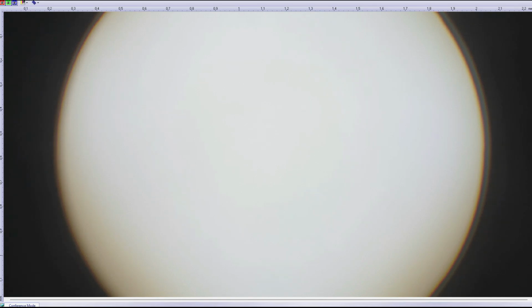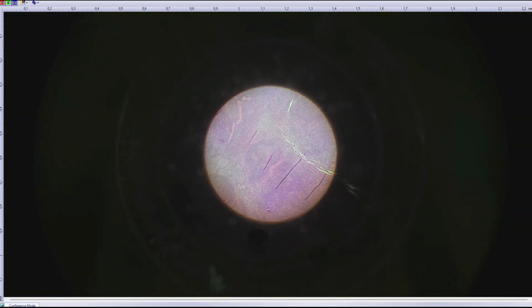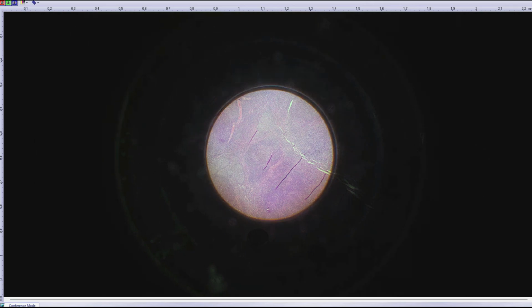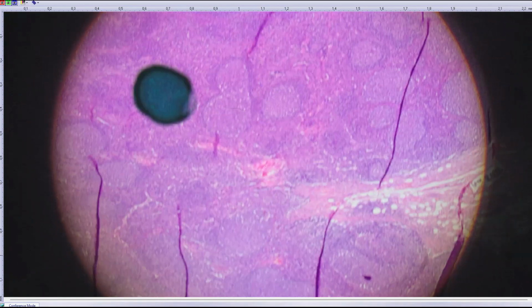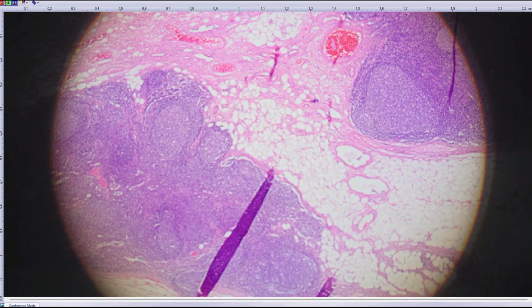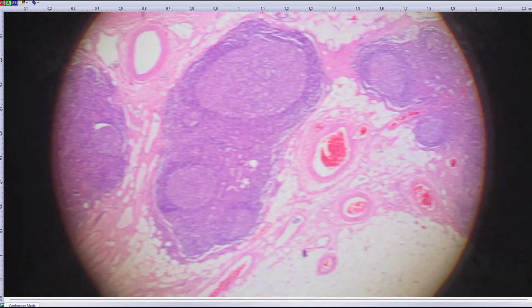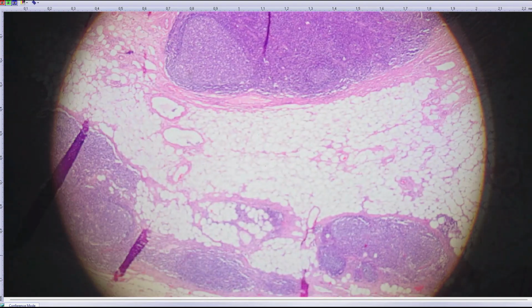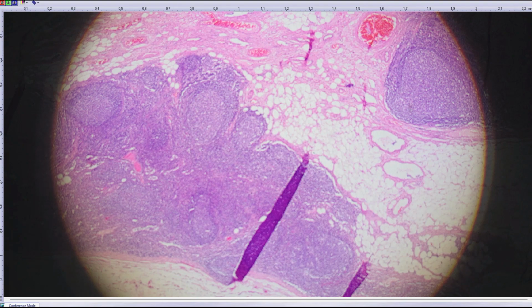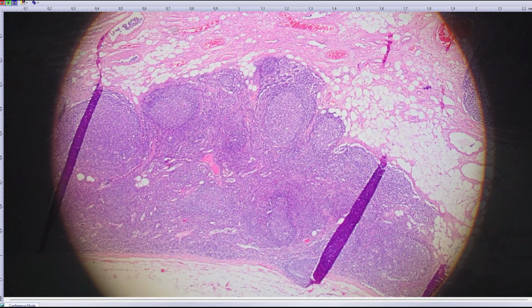And the second case is fresh. It's a 46-year-old male patient. Why is it so small? All right. And he has a history of something. I'm not going to tell you what, but it has to do with lymphoid tissue, of course. And over the last 5 years, we had repeated sampling of some lymph nodes because they seem to be enlarged. But always we just saw follicular hyperplasia.